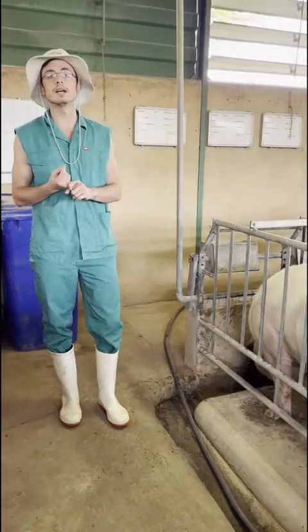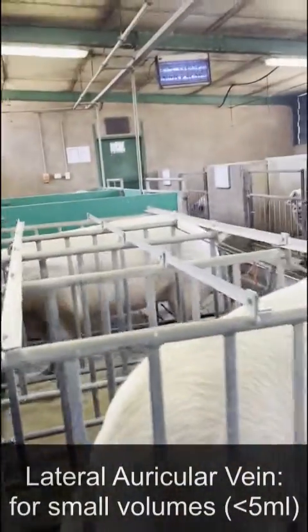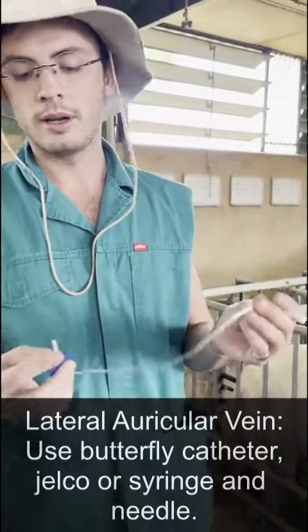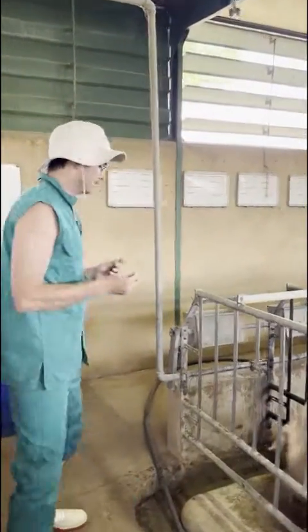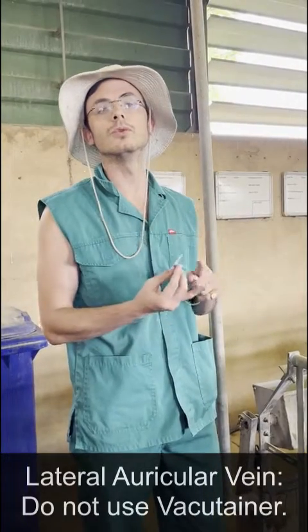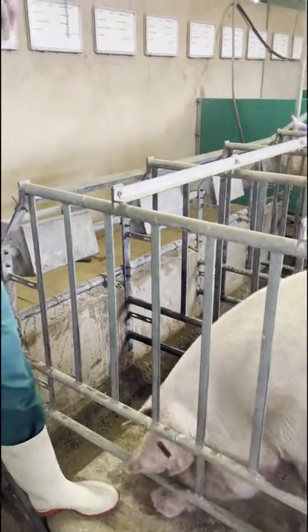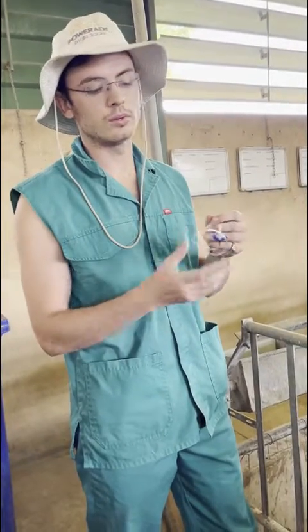There are a couple of places we can draw and administer blood, starting with the lateral auricular — a small vein. We're either going to be administering or drawing small amounts of blood, and we use the butterfly catheter for this — it's called that because of what it looks like. We don't use a vacuum container for this because the small veins will collapse. We insert the butterfly catheter into the lateral auricular vein, bevel side up, then attach a syringe to the back end to draw blood or administer medicine.